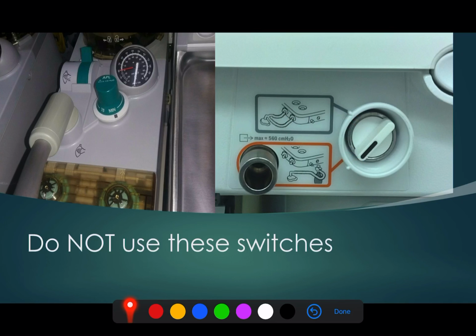If it's turned down, all of the gas that's in the anaesthetic machine, instead of going through the ventilator tubing, will just come straight out of here. The reason we have this in anaesthetic machines is sometimes we want to put in an additional type of breathing apparatus, especially for children, and so we use this common gas outlet. But for you, do not touch this. Make sure it is always in the ventilator side, and don't do anything with it. Don't touch it.